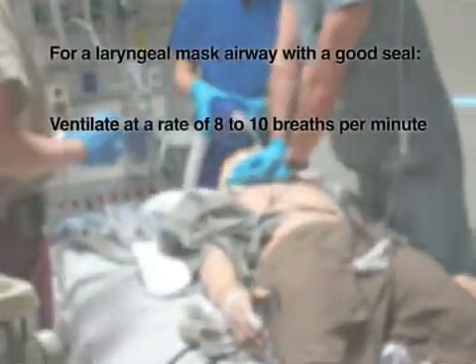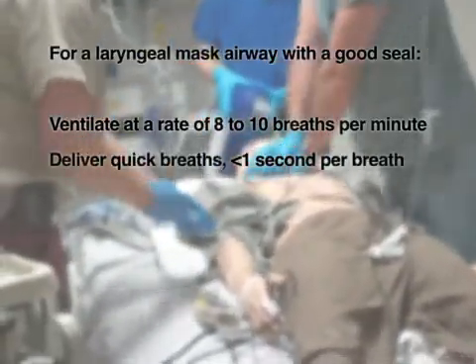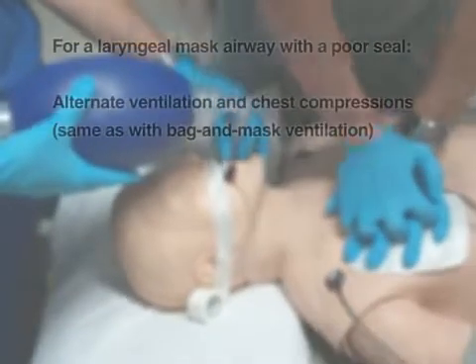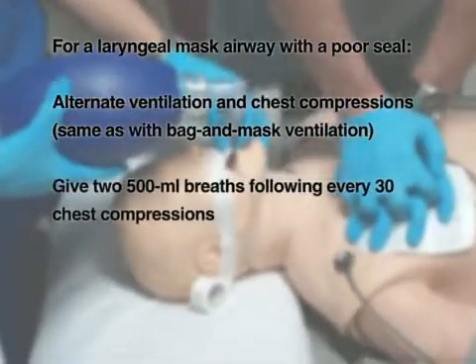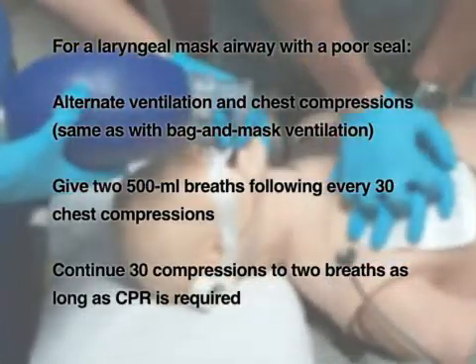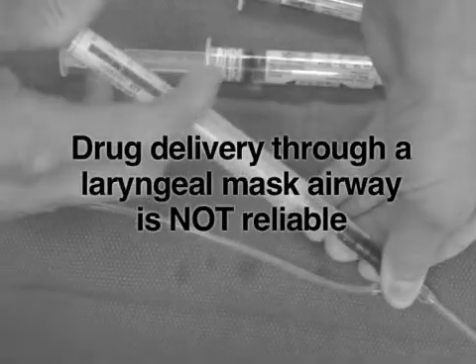Once the laryngeal mask airway is placed, the adult patient should receive 8 to 10 breaths per minute during continuous chest compressions. Deliver quick breaths, ideally less than 1 second per breath, each with a volume of approximately 500 milliliters. If you hear air leakage during ventilation, alternate ventilation and chest compressions, giving two 500-milliliter breaths following every 30 chest compressions. This ratio of 30 compressions to 2 breaths should be continued for as long as CPR is performed. Delivery of drugs through the LMA to the pulmonary epithelium is unreliable and is not recommended.